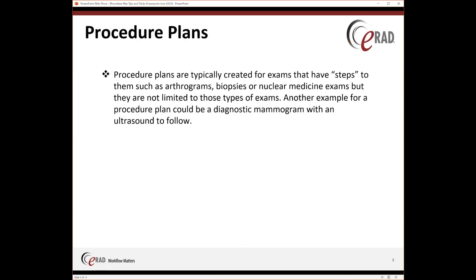Procedure plans are typically created for exams that have steps: arthrograms, nuclear medicine, biopsies. Where it's pretty highly used is also with mammography procedures — when you are scheduling a diagnostic mammogram that also needs an ultrasound to follow. But it can be used in a multitude of ways; there's no set rules for how you want to use it.